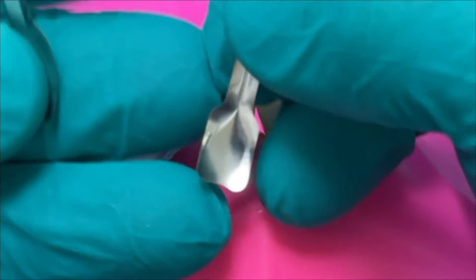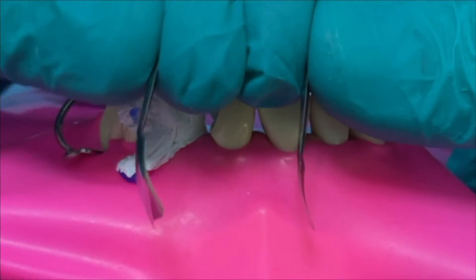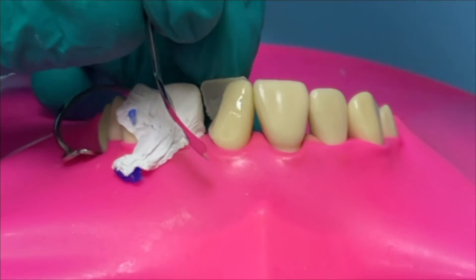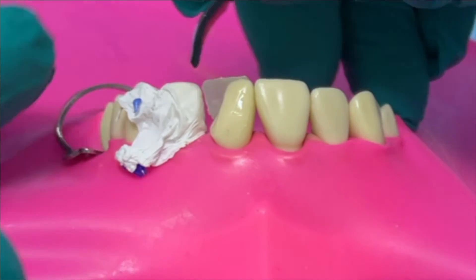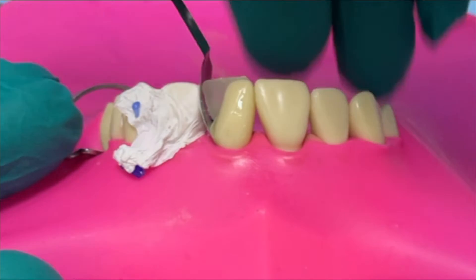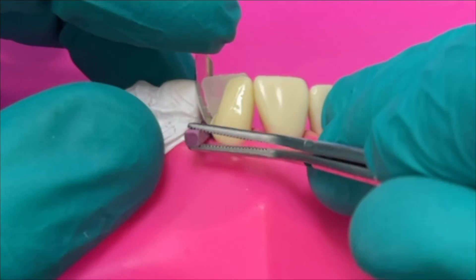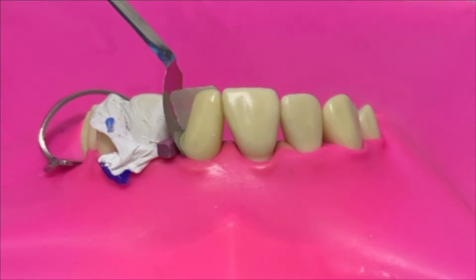More recently - three or four years now - Torviem came up with these anterior proximal strips. On the right I've got the medium and on the left the large. The medium is slightly less curved than the large; I'll often use the medium on the mesial proximal wall for anteriors where you want it a bit flatter, and the large on the distal. They also have a small which is handy. They come with a little arm on them which you can bend away to help secure them. These are much easier to place than the classics. Then we place a wedge - it's a large one on these typodonts - to overcome the thickness of the band and ensure a contact point when it's removed.